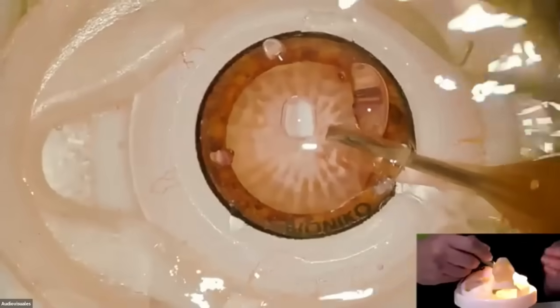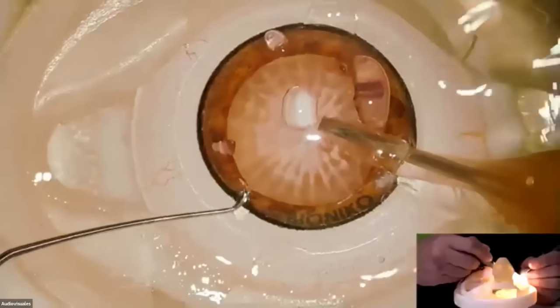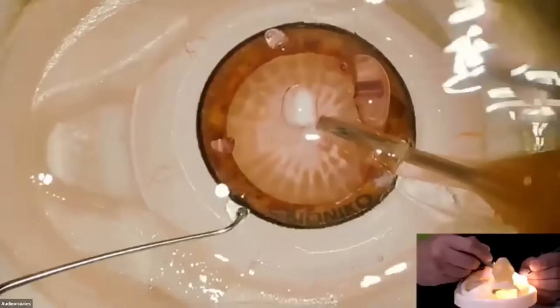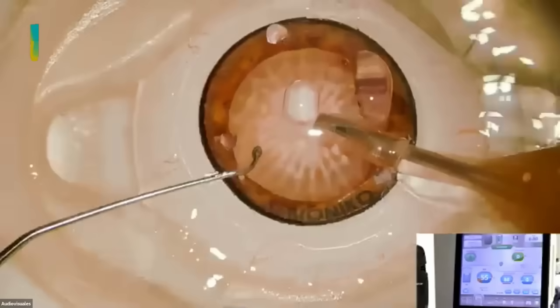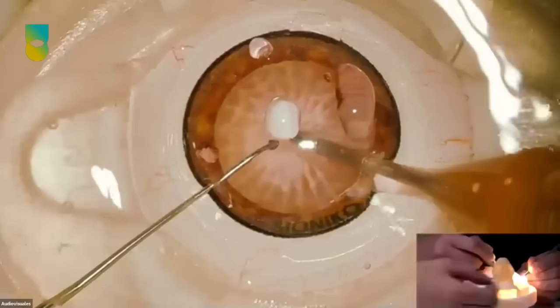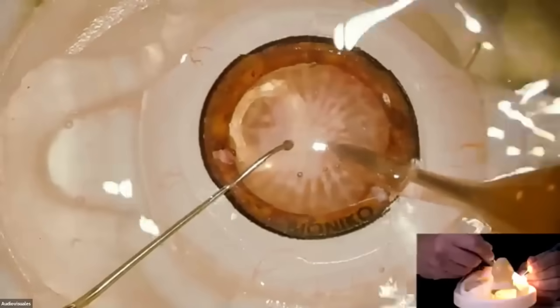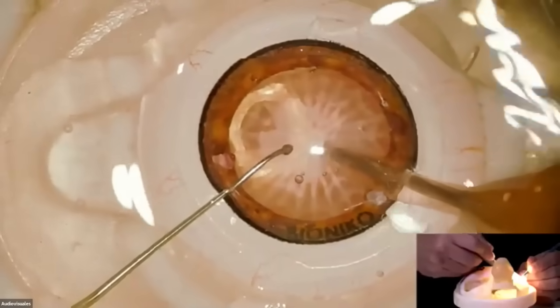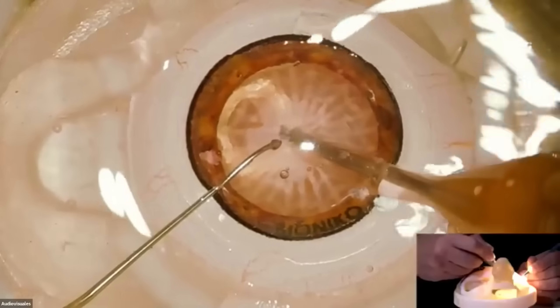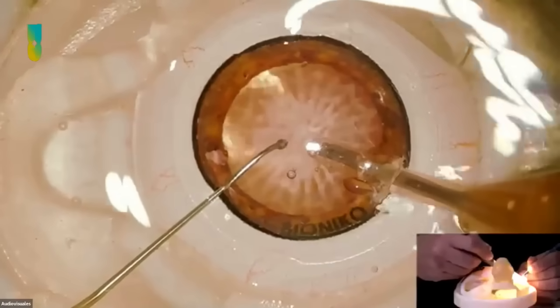Now he's sculpting, I think, for the fracture. So my advice here is to hold, yes, like this. You can hold the incision as well and sculpt, and then do the fracture. Okay. Perfect. So let's see how Pablo performed.